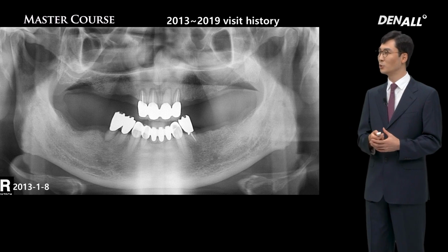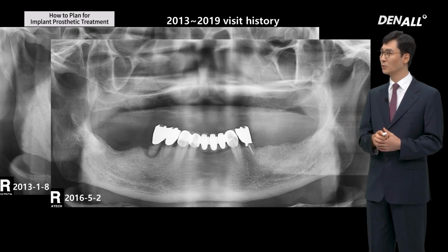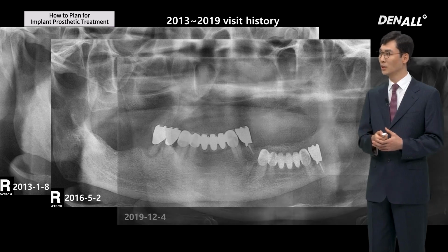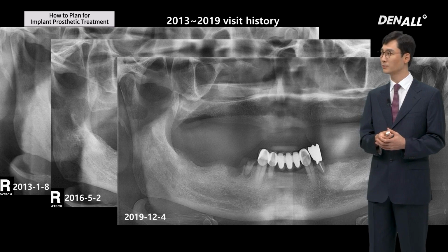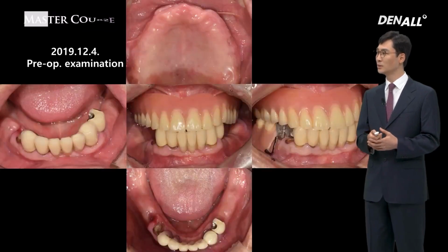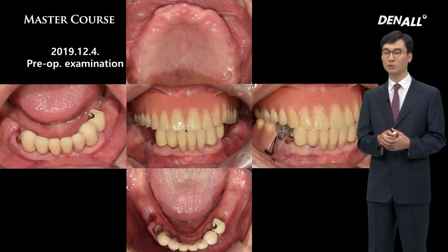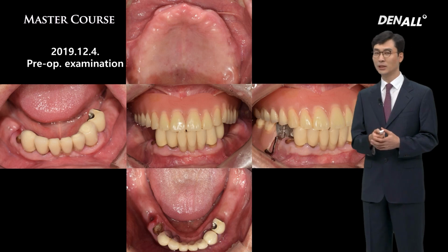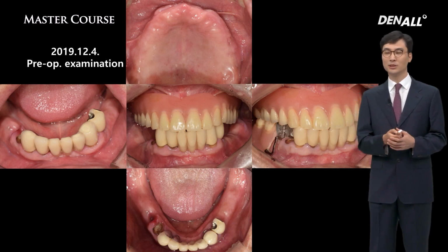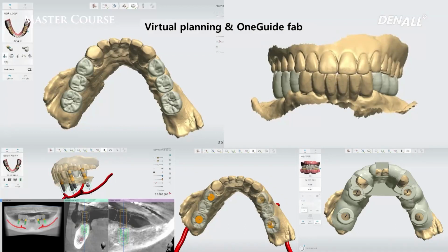This was at initial visit. The patient came in the middle as well. The patient was wearing full denture for the upper, and the lower, the abutment's condition worsened. This was when the patient came in for treatment. This is clinical image before surgery, and in the lower, you can see teeth that require extraction. Because extraction, immediate implant placement, and temporization was planned, I used the oral scanner. I did final virtual planning.